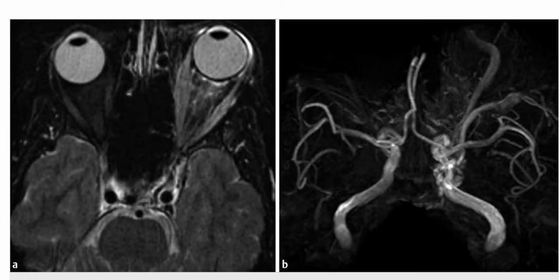So this is an adult patient presenting with orbital pain, visual loss and bruit. These are the coned down axial T2 weighted MRI, fat suppressed image, and the other image is the MR angiogram. So in the coned down axial T2 fat suppressed MRI, we can see that there is a convex lateral border and increased flow voids within the left cavernous sinus.